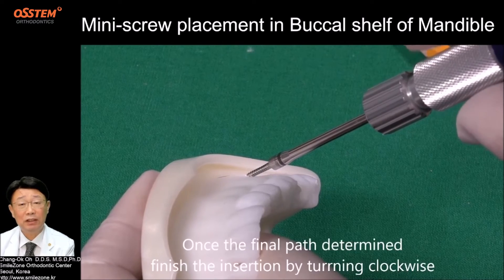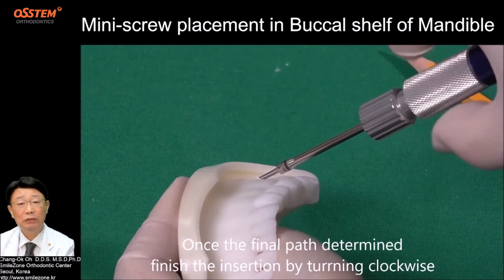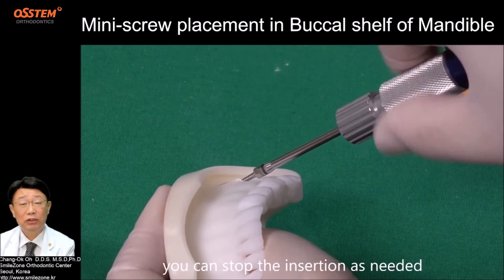Step 5: Finish the insertion. Once the final path is determined, finish the insertion by turning clockwise. You can stop the insertion as needed.